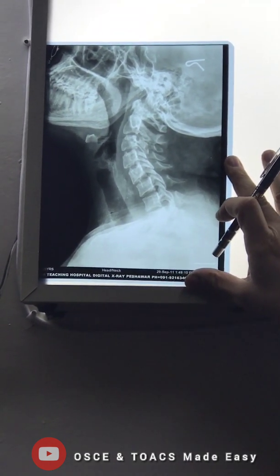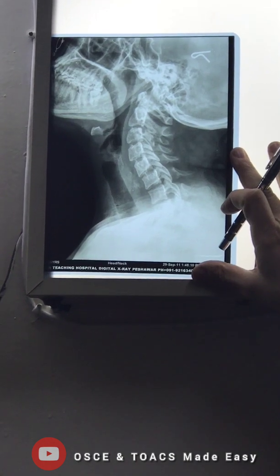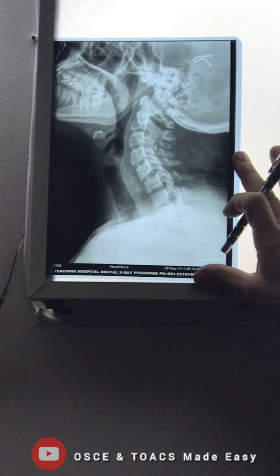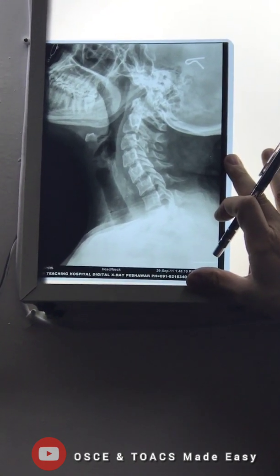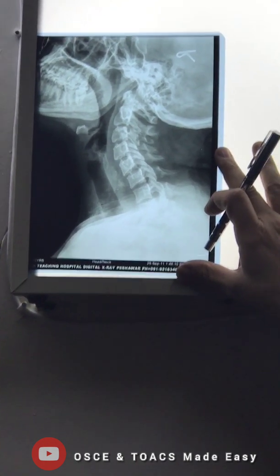Most probably it could be a retropharyngeal abscess, or it could be some malignancy.